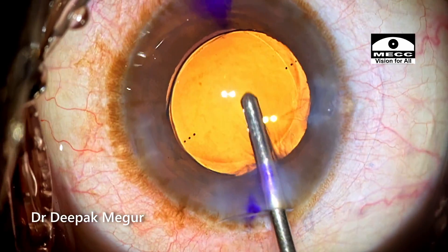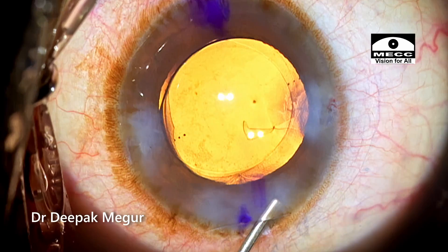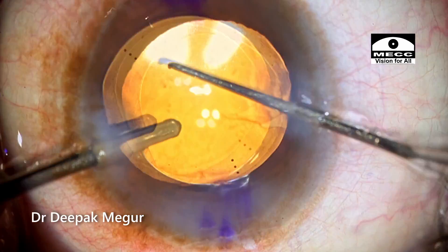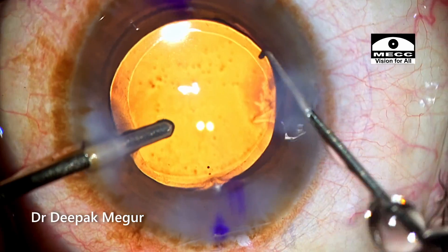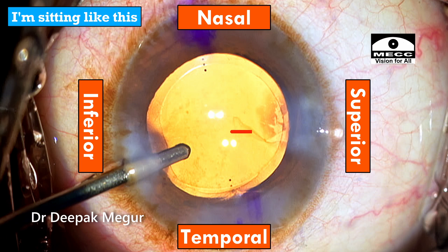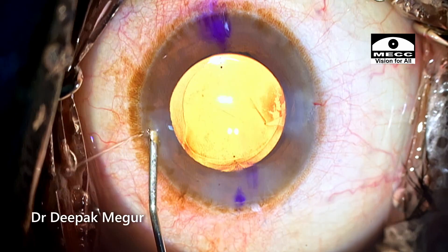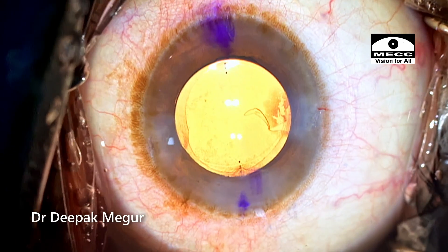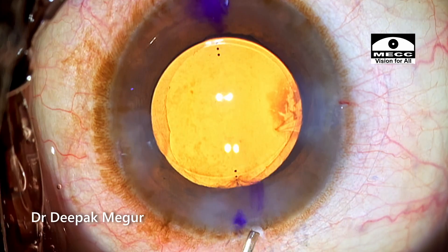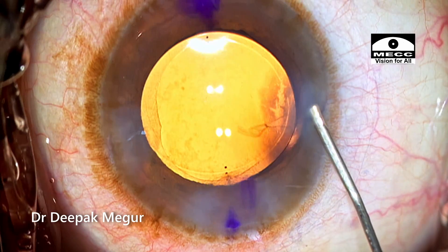Once the OVD both in front and behind the lens is totally cleared off, the side ports are hydrated and the main incision is also hydrated. This is the step I do before doing the final alignment. The lens is aligned into the desired axis and the side ports are being hydrated. I'm sitting on the temporal side and the Descemet's membrane detachment is in the superior quadrant — this is a very easy detachment to fix because once you put the air bubble, it goes into the superior quadrant and stays there most often, giving enough tamponade for quick reattachment. An inferior detachment would always be much more difficult to manage compared to this one.